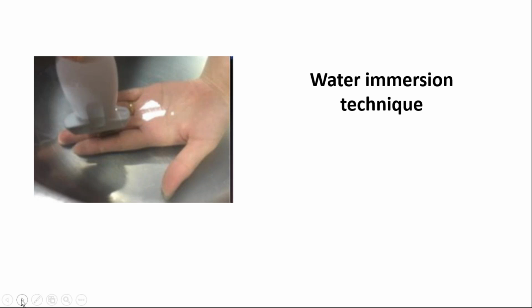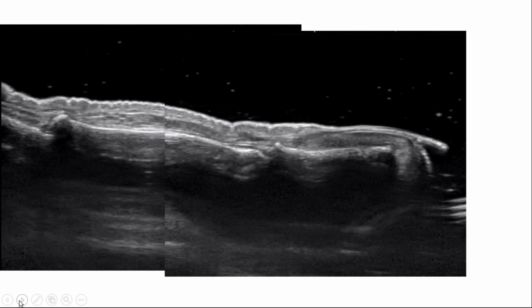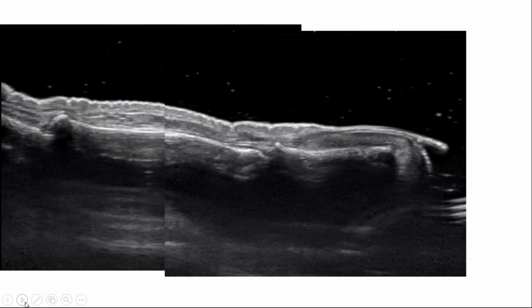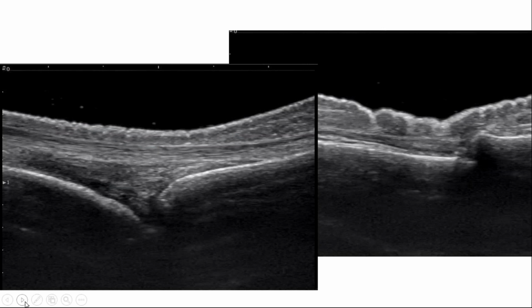That's kind of the way we do underwater ultrasound anyway. You don't touch the part. And you have a big pool, right? You can pretty much check everything. Yes, I have a giant pool, so I can look at everything. You don't have any problem. So not beyond this point. Basically, the area where you would put the gel is the level you want to keep immersed.